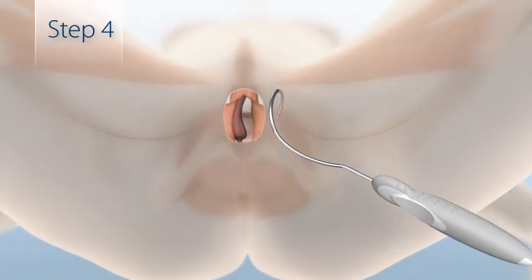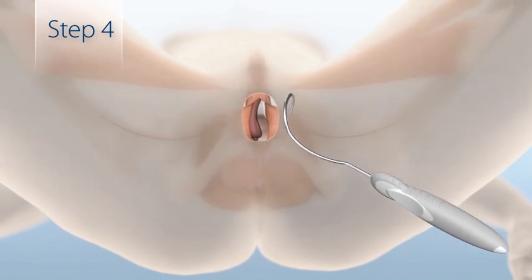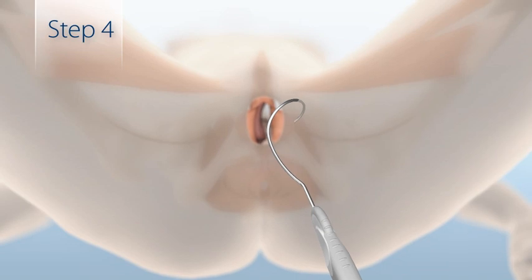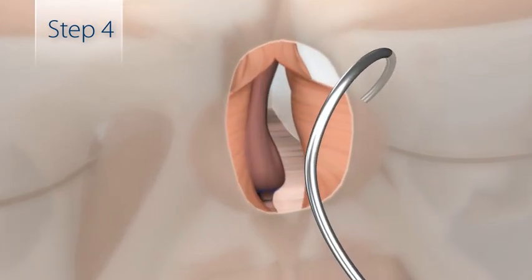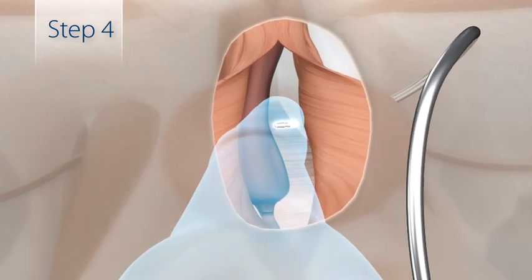After 2 pops are felt, stop advancing the needle and drop the needle handle toward the midline to align the needle path. Rotate the needle until the tip meets your finger and bring the needle tip high into the perineal incision.